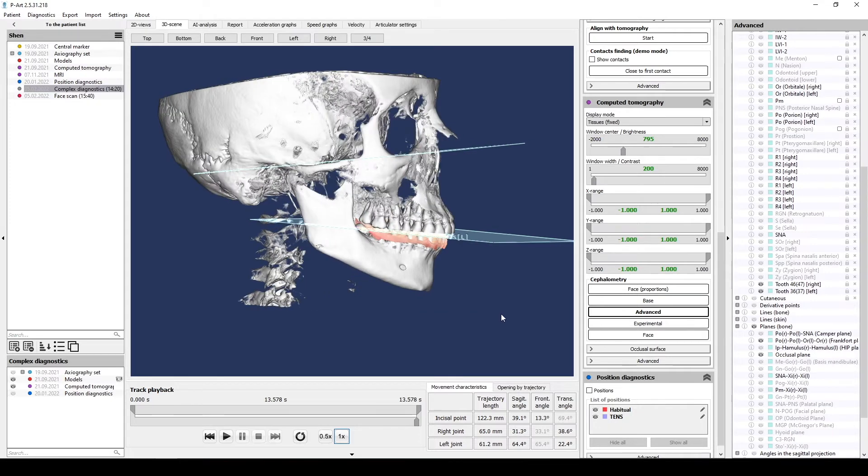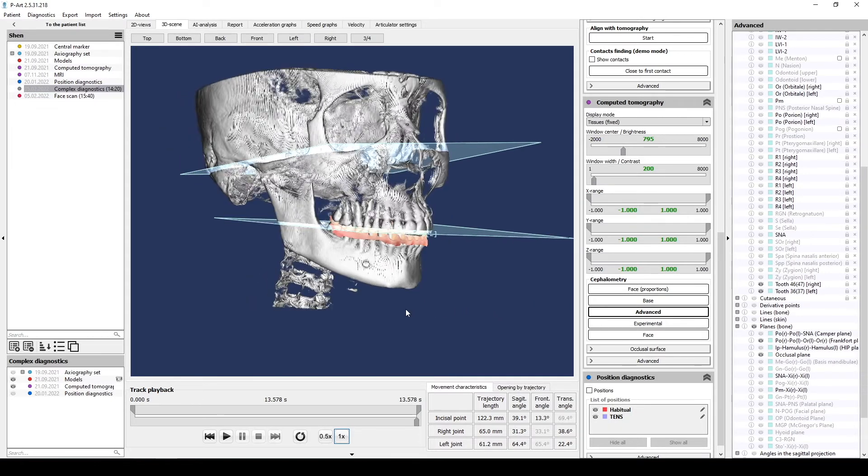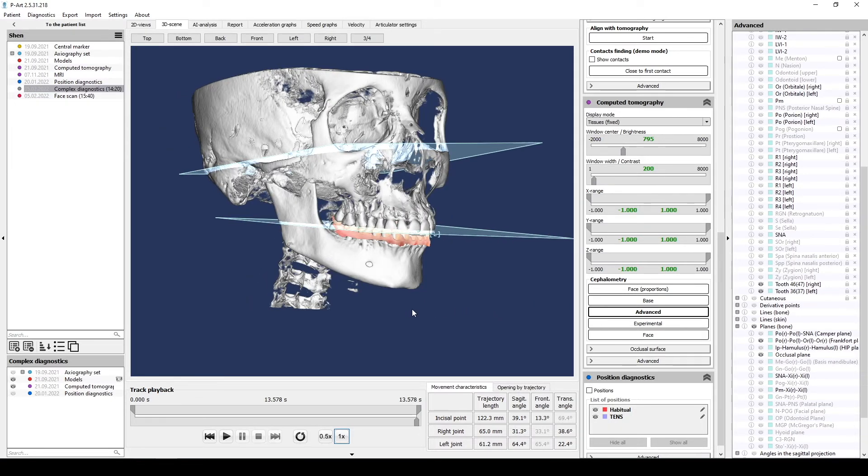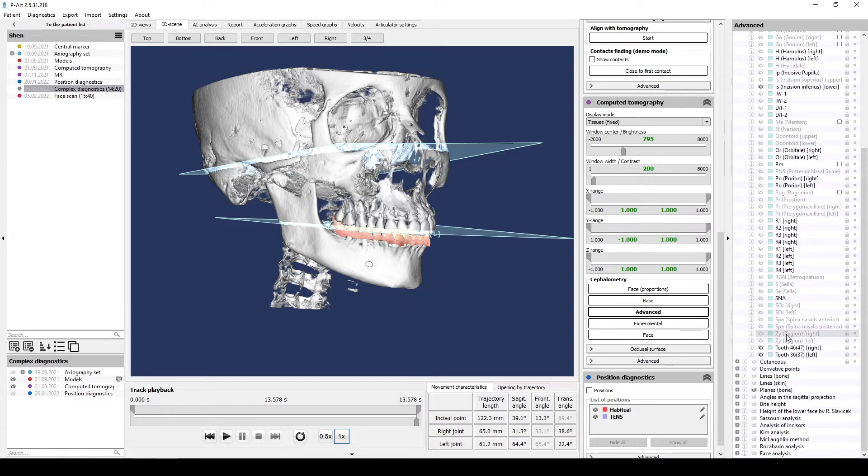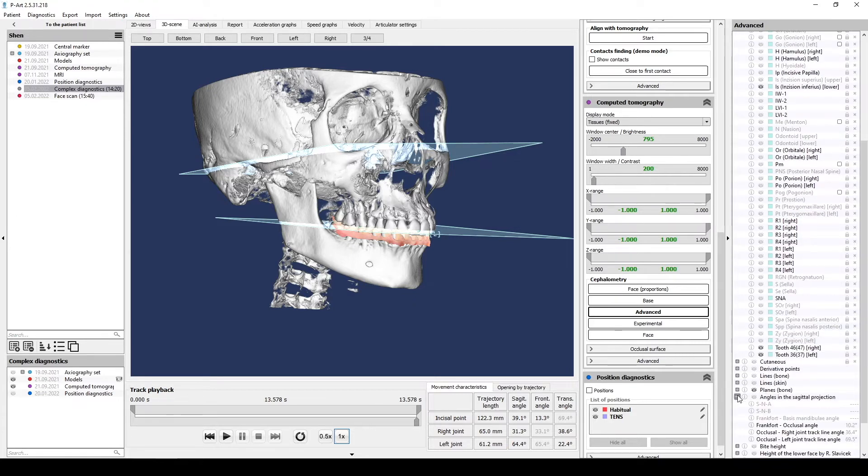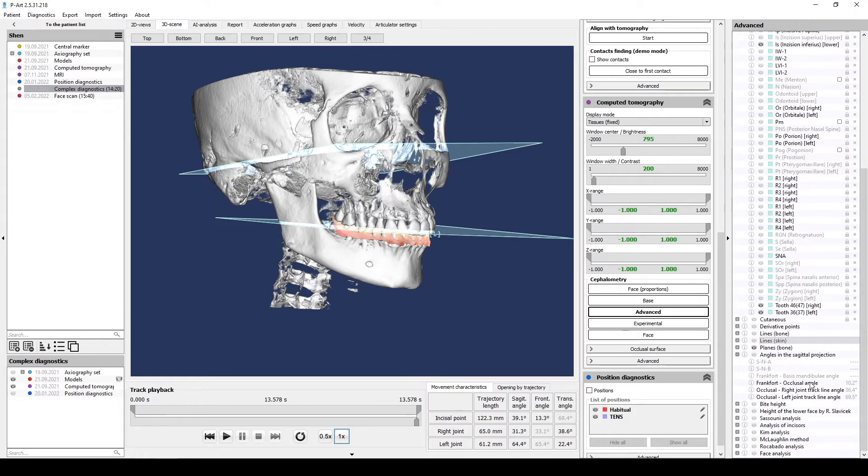Now to find angles between occlusal and Frankfurt planes we need to open angles in the sagittal projection directory. Between Frankfurt and occlusion plane angle is 8 degrees. It's a range of normal for Frankfurt occlusal angle.